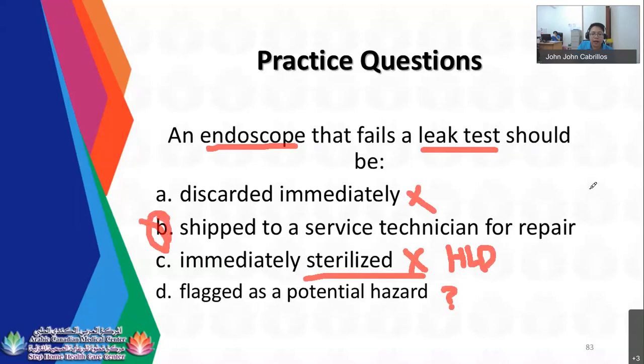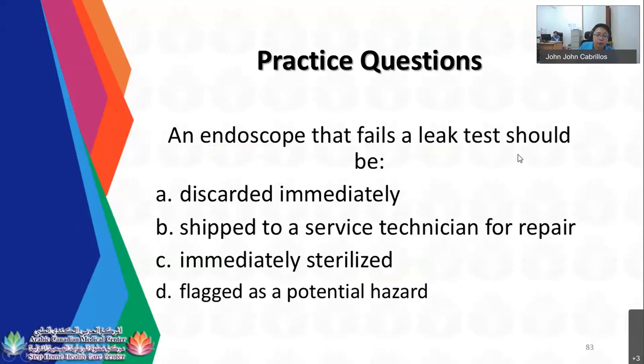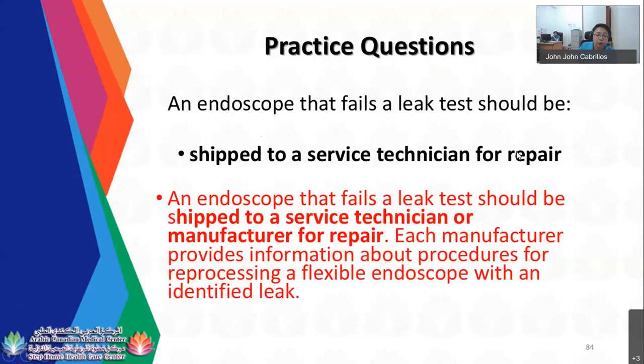So guys, please be reminded that before sending your endoscope, or before sending any instruments for repair, you need to do the high level disinfection so that your biomedical engineer will handle the instrument safely. If ever it needs to be sterilized for some instruments, then you need to sterilize them before sending that equipment to a biomedical engineer for repair. So an endoscope that fails a leak test should be shipped to a service technician for repair. Each manufacturer provides information about procedures for reprocessing a flexible endoscope with an identified leak.